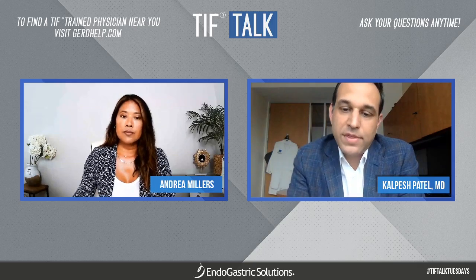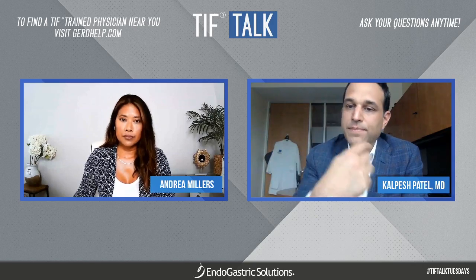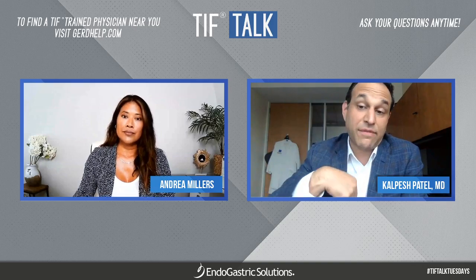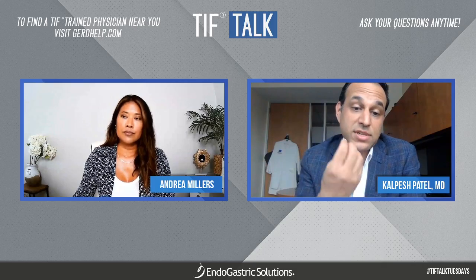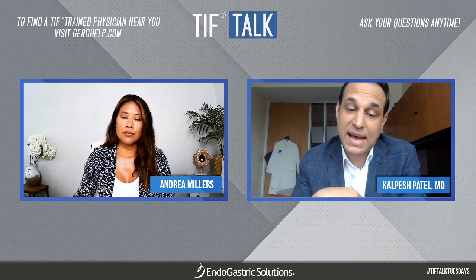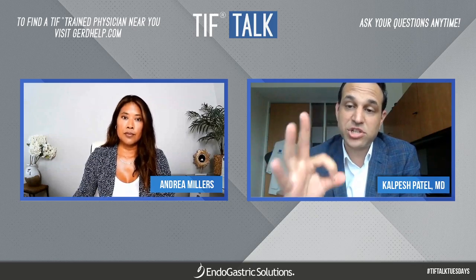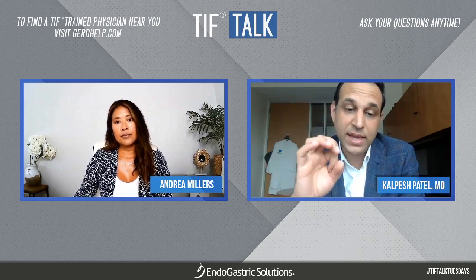So one of the more common things that we'll do is endoscopy. Endoscopy, of course, is a camera that's placed through the mouth into the esophagus and stomach under some sedation. And that allows us to get a direct visualization of the esophagus and the stomach and that critical junction between the two. And some things that we're looking for when we do that is there a hernia, meaning has the stomach or is that junction shifted in your body that's preventing it from closing very tightly?